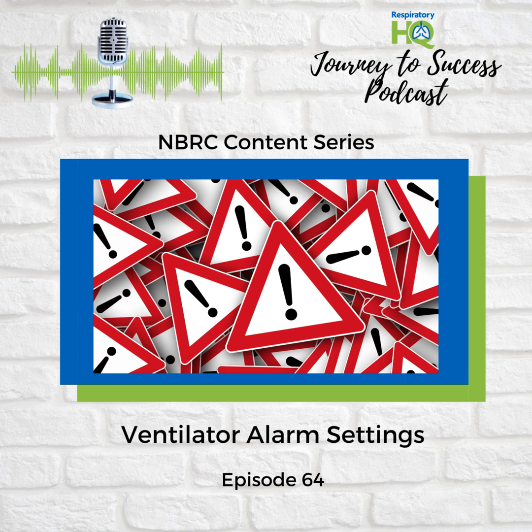And the second category is patient events. These are changes in the patient's own medical status that the ventilator can actually pick up on. Such as? Like if the patient's breathing pattern suddenly changes, the alarms can flag that early on, so it's watching both the machine and the patient. Okay, so that's the why. We understand the fundamental need. Now let's get into the what.